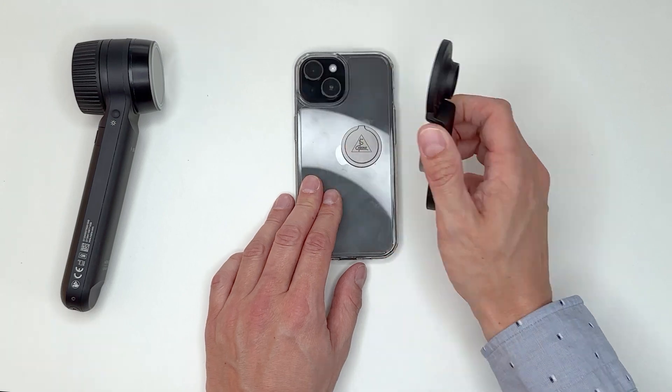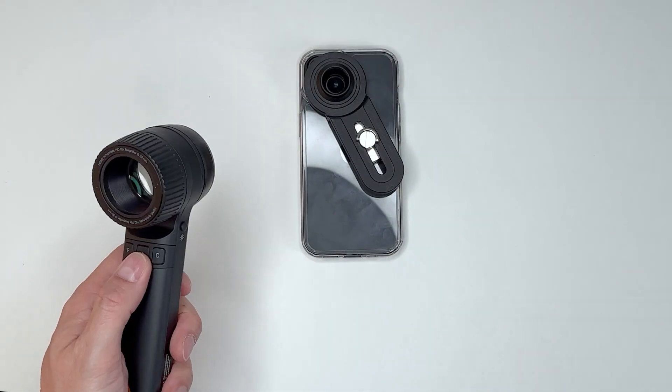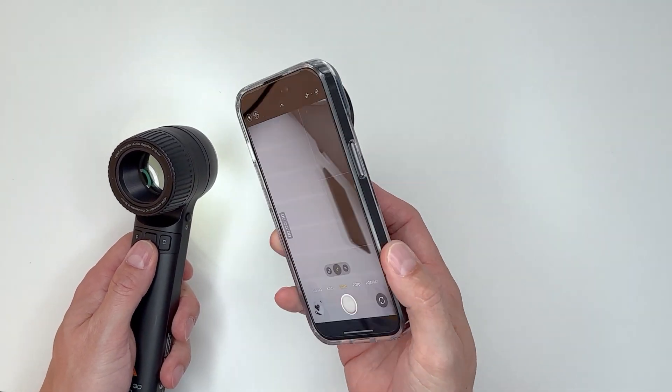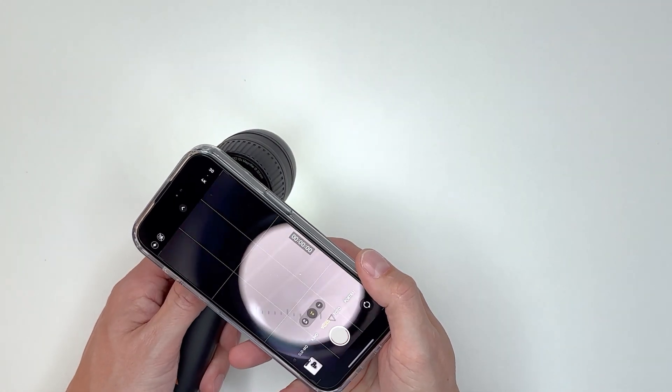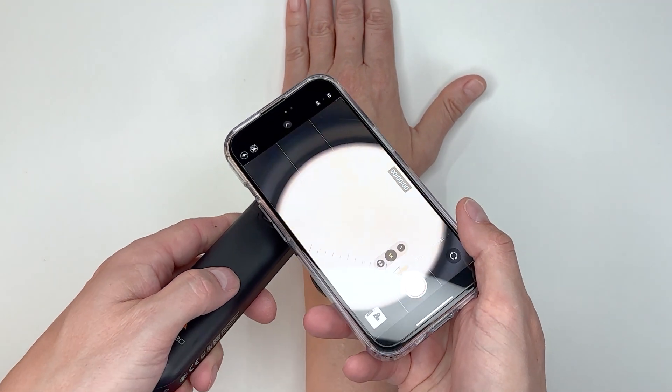The adapter can be removed at any time while the fixing button remains on the smartphone case. Finally, you can attach the phone with the magnetic adapter to your Heine Dermatoscope. You are now ready to take photos.